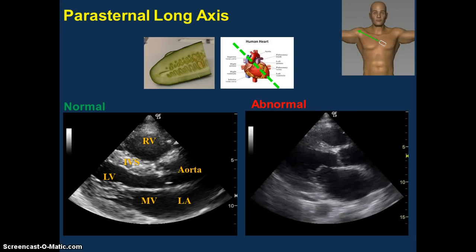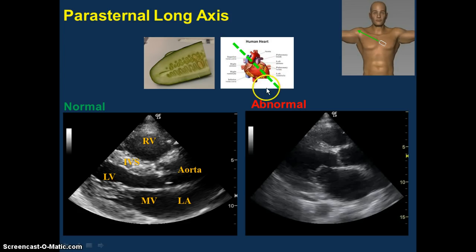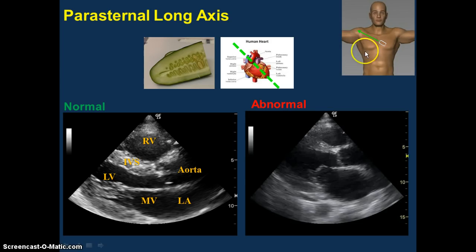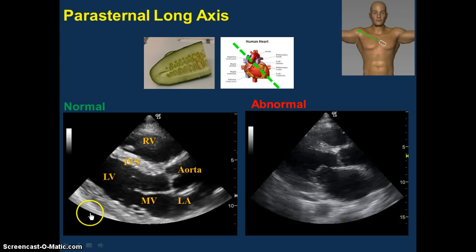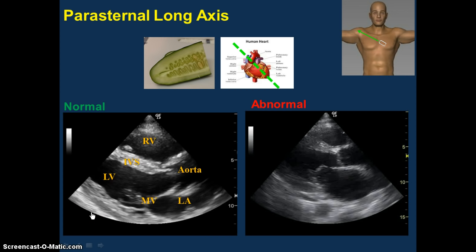The first thing you're going to do is put your cardiac probe up at the left sternal border with the probe indicator in the cardiac settings pointed to the patient's right shoulder. What that does is cut the heart along its long axis from base to apex. This gives you a nice bullet-shaped left ventricle, looking from the patient's left-hand side towards their right — the anterior portion all the way down to the posterior portion. This is down towards the apex, this is up towards the base. The different structures you need to be familiar with in a parasternal long axis view are several.